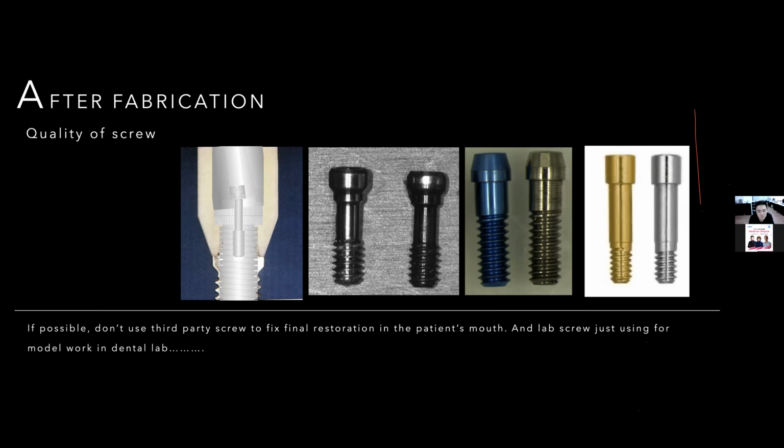So in my lab, I never use a third-party screw. Sometimes I will use a lab screw, but I never use and offer it to my customer, because it's very, very dangerous and easy to fail for your case.